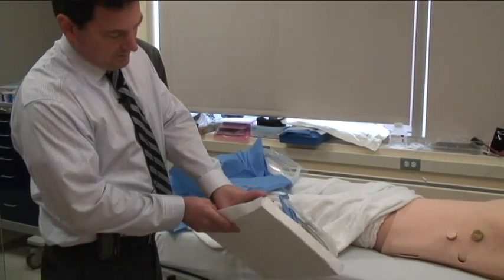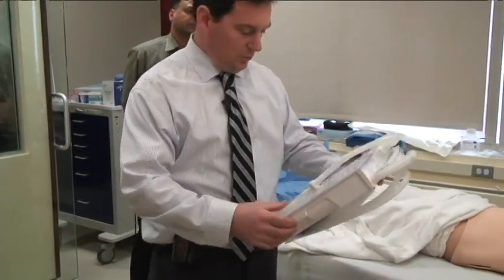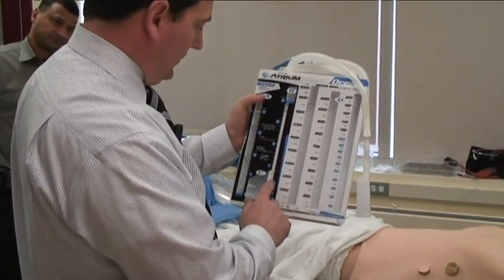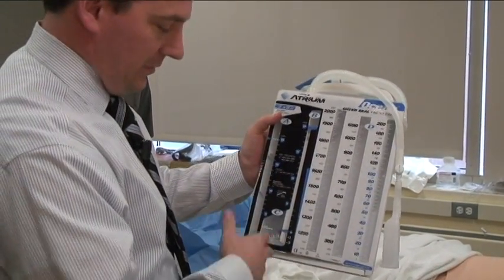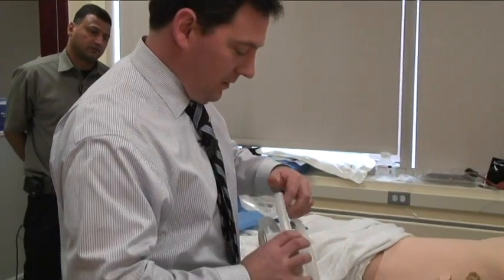So you take it out of the box. I can put that in the trash. And you'll notice you have a collection chamber here. This is your air leak indicator, and this is your water seal here. And this column over here, which you also put water in, is your suction limitation, so that you don't have too much suction. It sort of protects you from the direct suction from the wall.